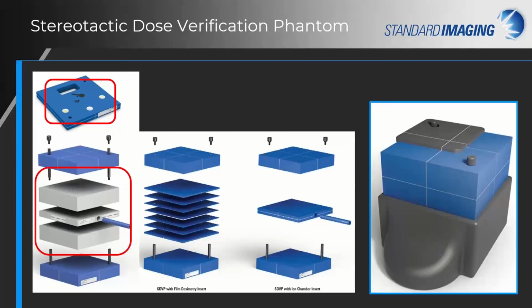The top hat and cradle are newer additions to the SDVP. The cradle lifts the phantom to securely position it for posterior lesion QA. The top hat includes tighter fiducial marker placement to facilitate fiducial tracking of smaller targets.